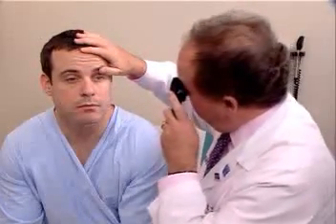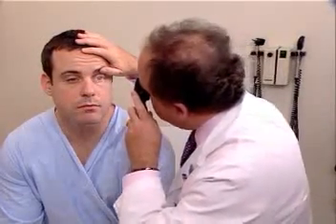We repeat the same procedure on the left eye using your left eye and holding the equipment in your left hand. And again, I'm about 15 to 20 degrees off of midline, and keep looking in the distance. And as one gets closer to the patient, the diopter wheel focuses first, as we go through the cornea, the lens, the vitreous, and now the retina.